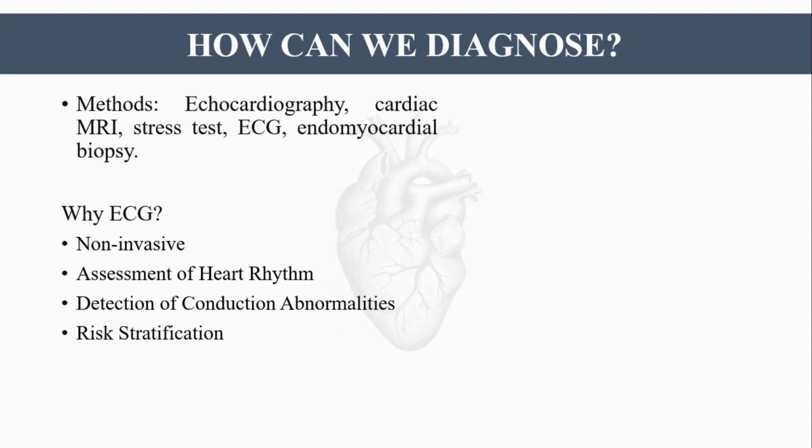Moreover, it can easily assess heart rhythm, which means that it can easily locate irregularities in the heart's electrical activity. It can also find abnormalities in the heart's electrical system. And risk stratification means that ECG waveform analysis helps to assess the risk of harmful cardiac events.